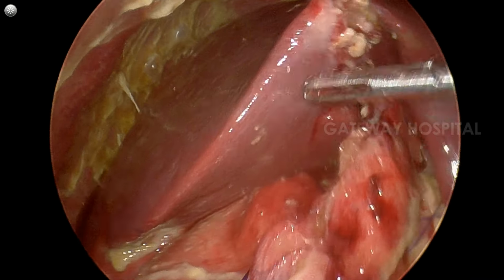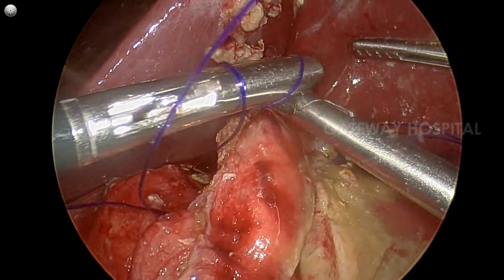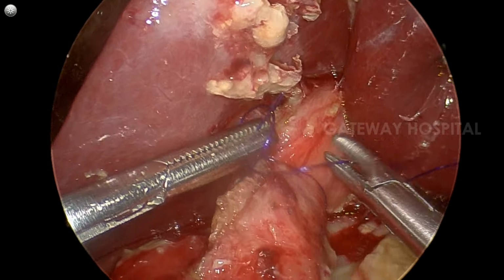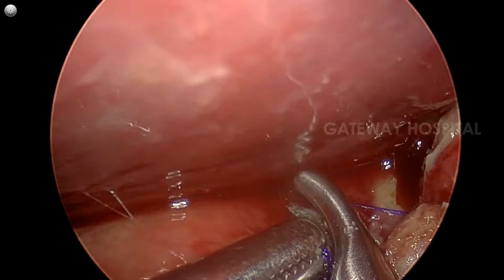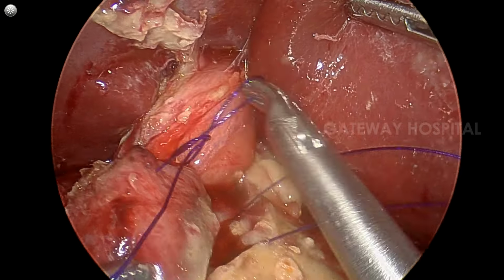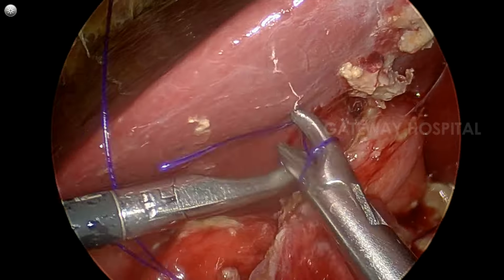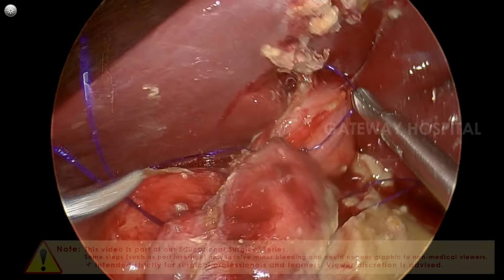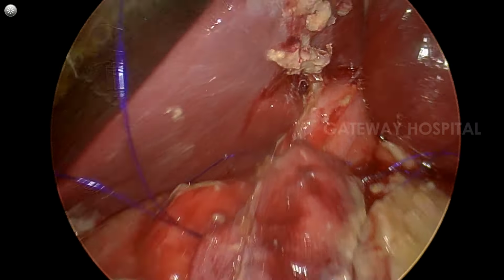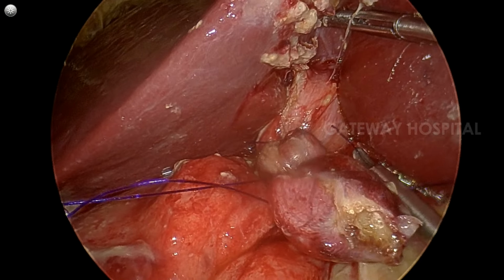The first suture is at the center of the perforation, and while taking this suture, you have to make sure that you are not including the posterior wall of the duodenum. And then one more suture on the upper aspect, and the third suture on the lower aspect of the perforation, and you keep them without tying. After that you place the falciform ligament over the previously placed sutures and start tying them one after the other. First we are done with the far away suture, then we come to the central suture, and then we come down to the third suture.